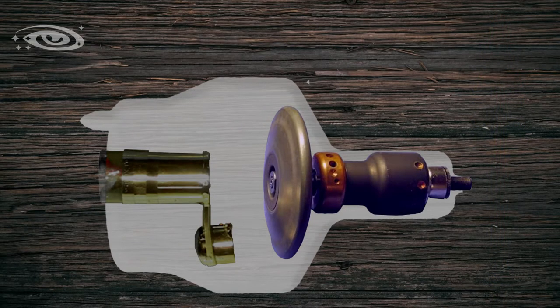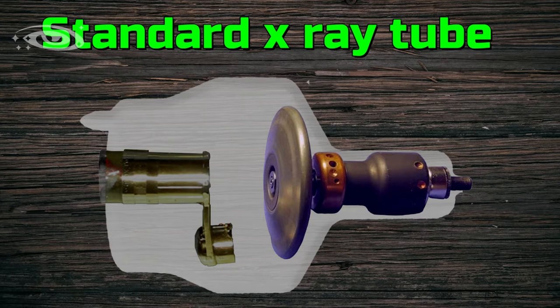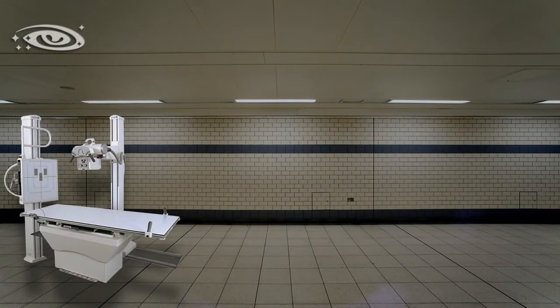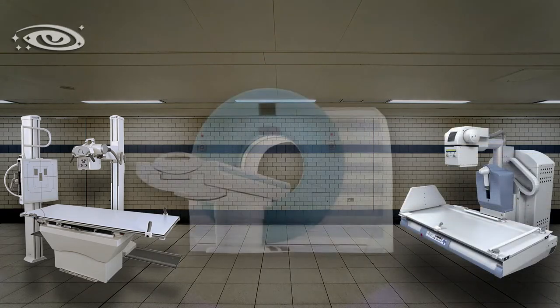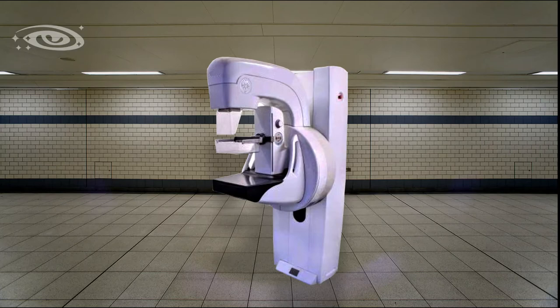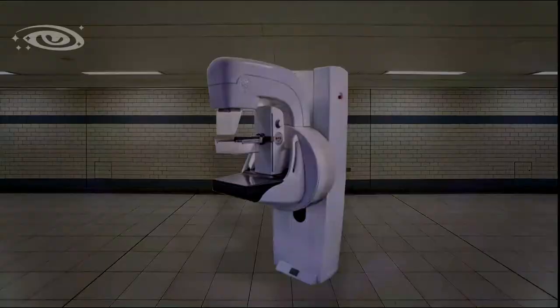At last, this rotating anode X-ray tube becomes standard X-ray tube in the radiological field. Still now, we are using this X-ray tube. And this rotating anode X-ray tube is used in general radiography machines, fluoroscopy machines, computed tomography machines, mobile X-ray machines and mammography machines.